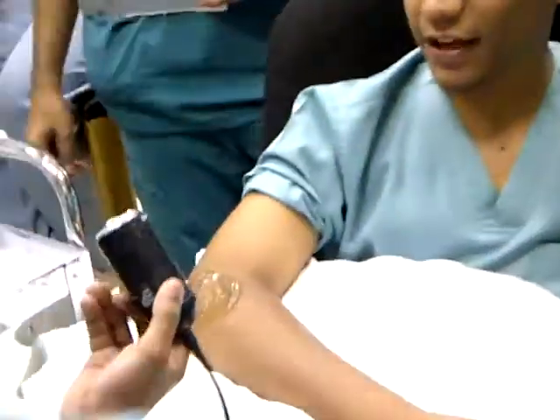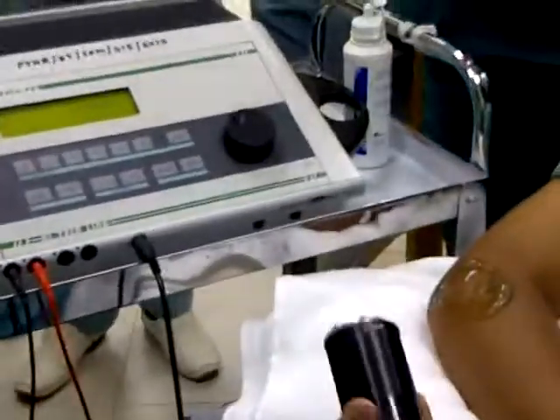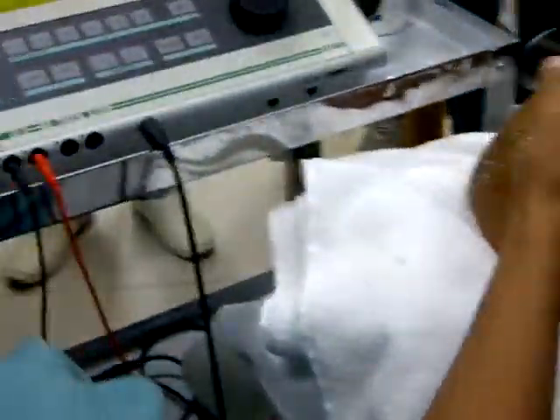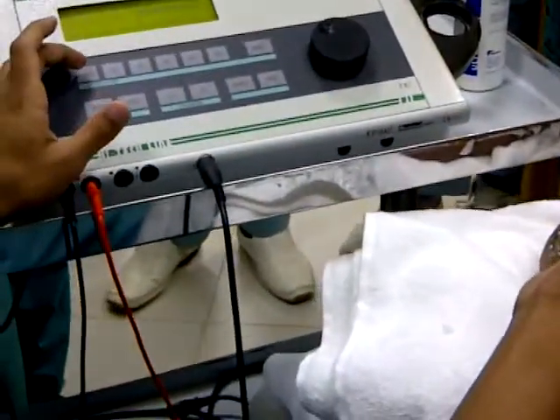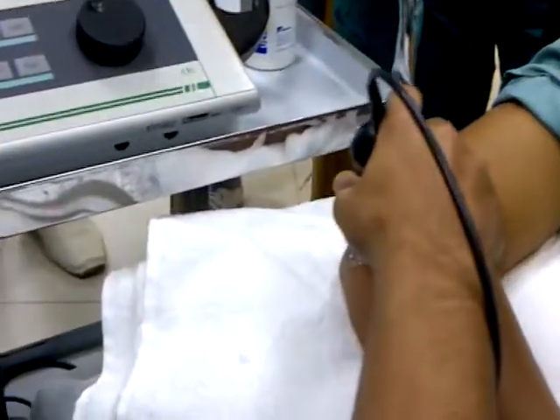No brain, no benefit. All simple things, simple logic. Very easy. So it's your dominant hand that is going to do the work, then I can easily manipulate the buttons on the machine. Okay. Start now.